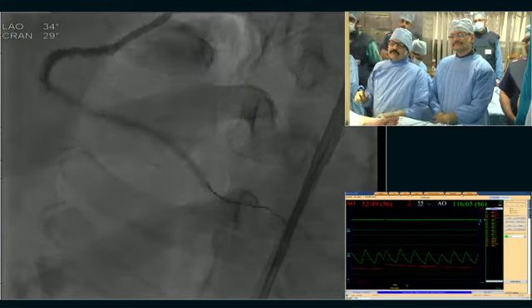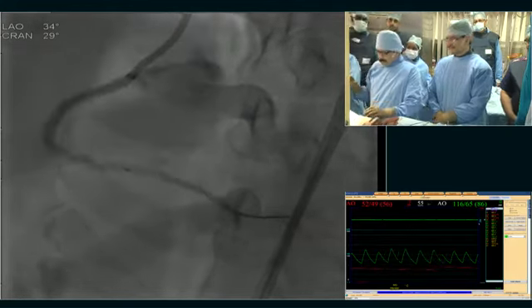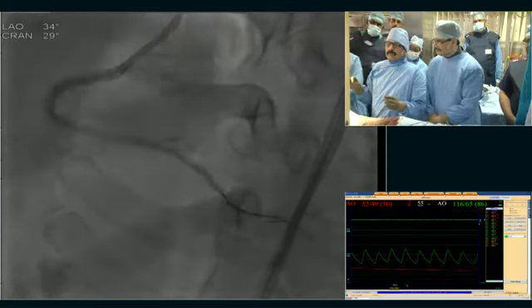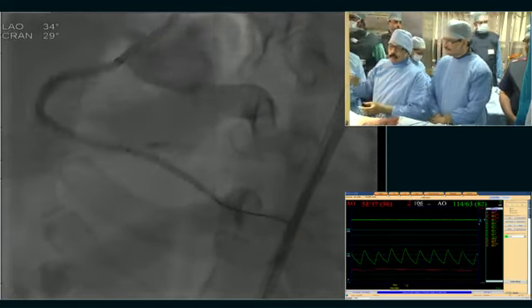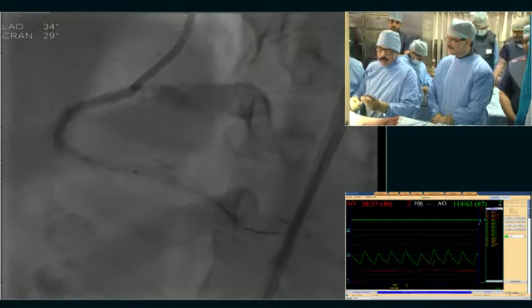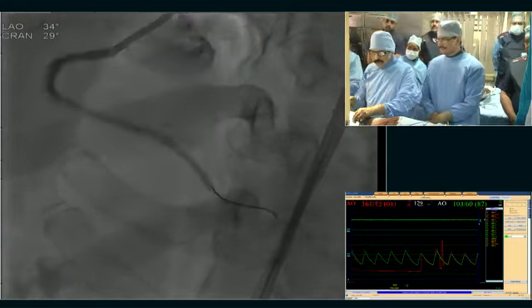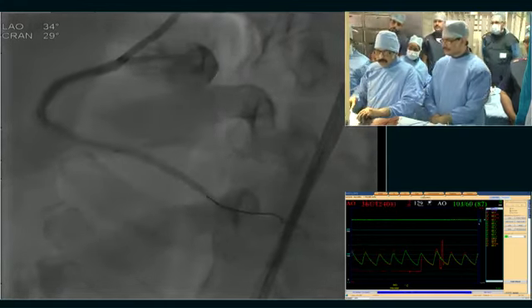Still lot of ISR is there. Put a bit more bend. Whisper also is a good wire. I will try even whisper also. Give me whisper.